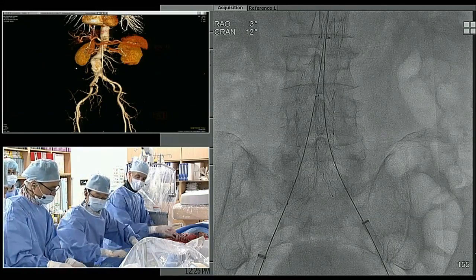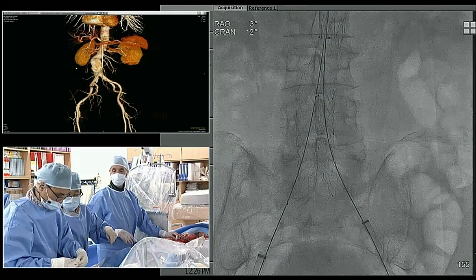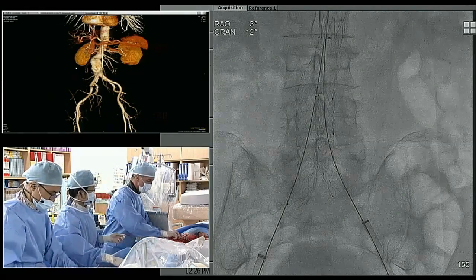We'll take this one off. So we're just going to manage our bleeding here while he's ballooning. Let's pull the panel on follow-up surveillance. Who still is doing CT angiography and who's doing ultrasound-guided surveillance of these endographs?